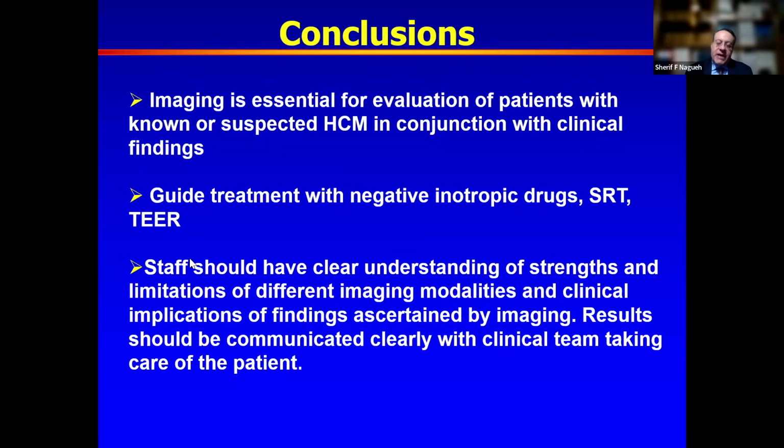So there is some time, but in general, as soon as the patient comes off the treadmill, one wants to acquire the signals. I will say this also, some sonographers are much more familiar with treadmill exercise scanning, much better than supine bike scanning for other indications, say for wall motion problems, looking for coronary disease.